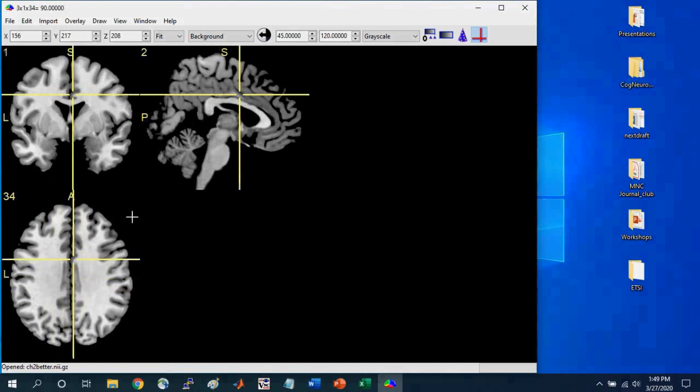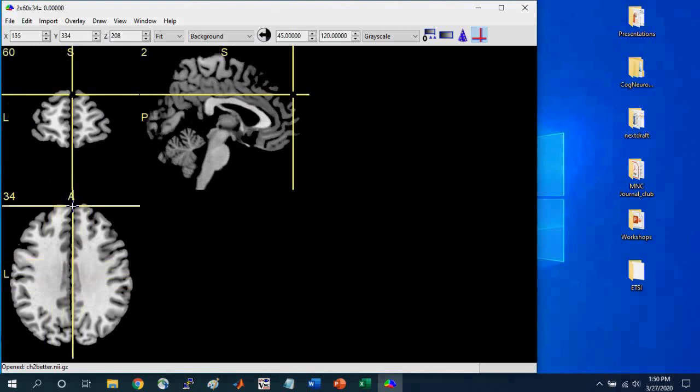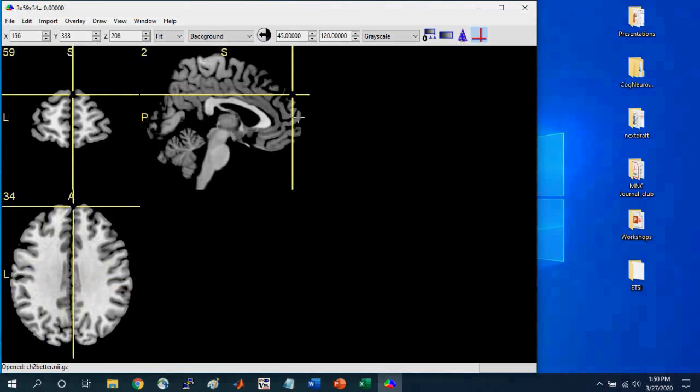If I select all the way in the anterior portion in this axial slice, you see that the crosshair goes all the way to the front to the anterior portion in the sagittal slice, okay?